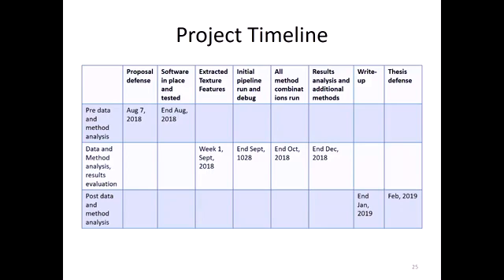The concern I have is probably beyond the scope of the project, to be honest. I don't think it matters much for what you do because you're using an ROI-based approach, and the ROIs were constructed separately in the two data sets, which is actually probably better for this. But just looking at those images, it's very clear to me that there is a distortion in the nature of the data acquisition between your diffusion weighted images and the T2s. They don't align with each other.